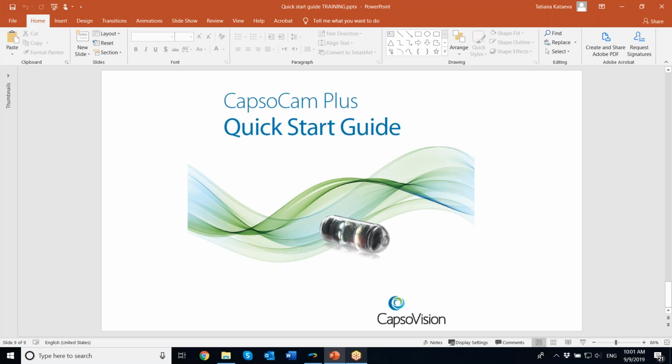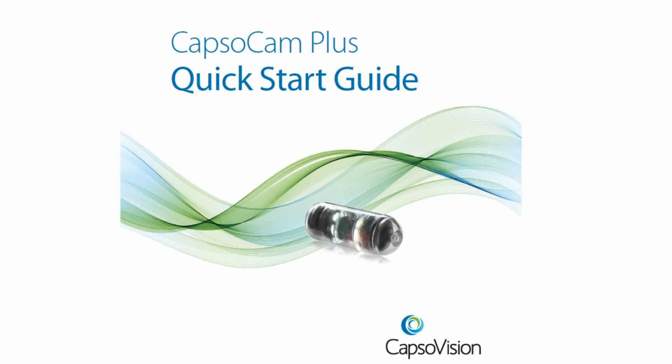Okay. Welcome to the webinar on Quick Start Guide. We created this document to help onboarding customers to have everything in one place. It's actually a binder that contains printed files, and here in US, the sales rep brings it to the customer during the first visit.